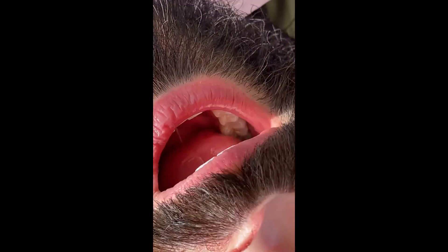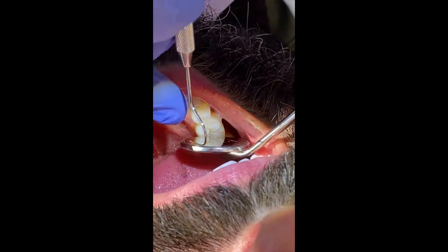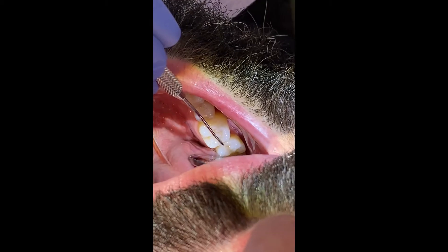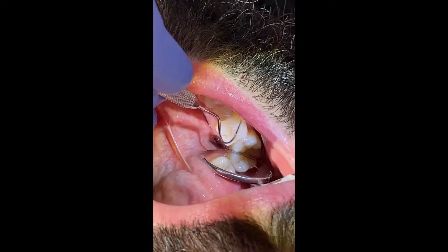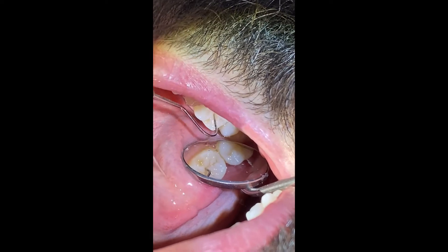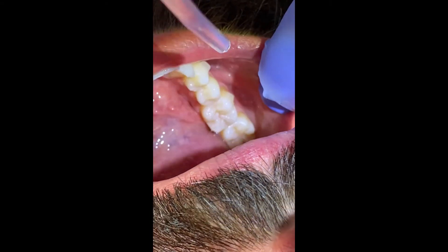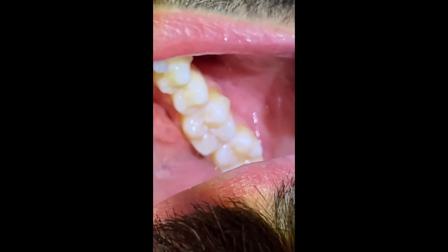We're going to use the mirror and the explorer to make sure that the surfaces of the teeth are nice and clean from all sides, just making sure we don't have any more food particles or debris. It looks nice and clean, so let me put a little bit of air on that too. That is a wonderfully clean occlusal surface that is going to be ready for a gorgeous sealant.